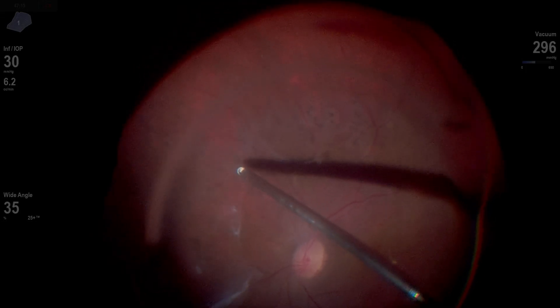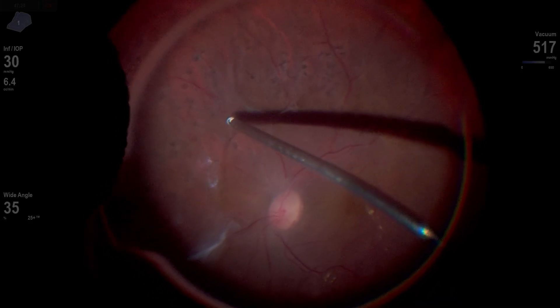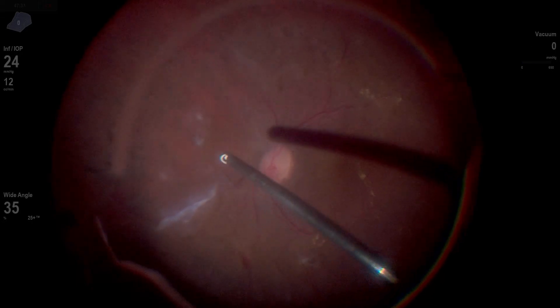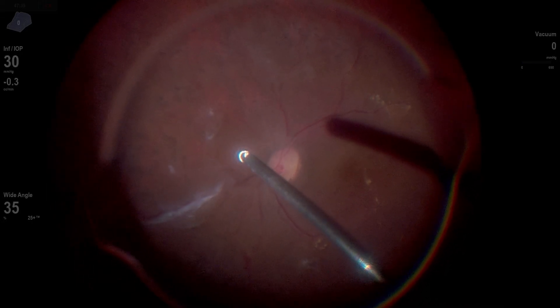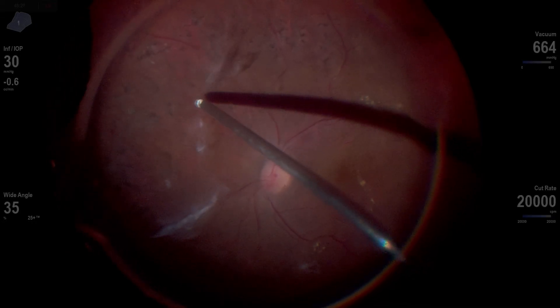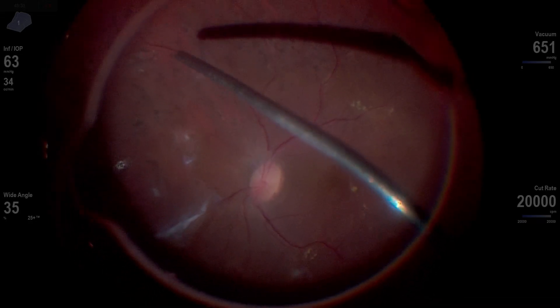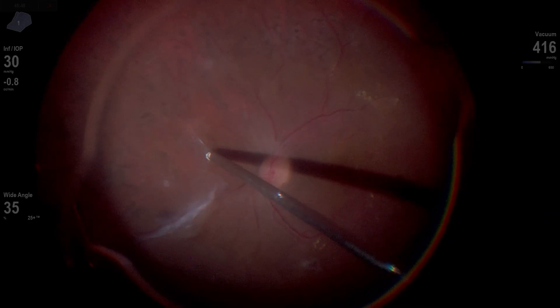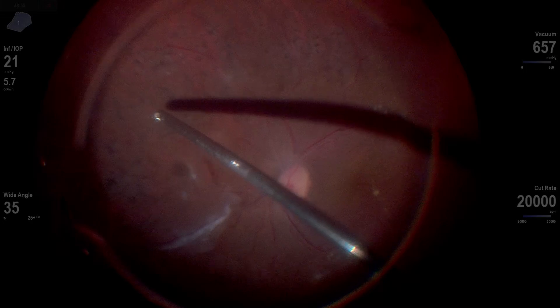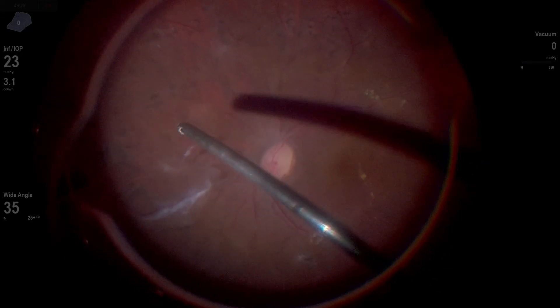Now there's a large plaque of vitreous here inferior to the nerve in the mid periphery — it's difficult to see because it's translucent, unlike the other fibrosis. This is a big plaque with an area being pulled on, so I'm going to work along that area and decide it's not yet time to get that up. I go back to working on the separation between some of this nasal vitreous and this linear fibrotic plaque. With aspirating and lifting, I'm actually able to get a little space there and then go with my cutter over that area and remove that vitreous — it's now up off the retina. I'm lifting and watching to see how it's pulling on the plaque along the superior nasal arcade and how it's pulling inferiorly, because that's where you could really run into trouble if there's distal traction attached to that vitreous.